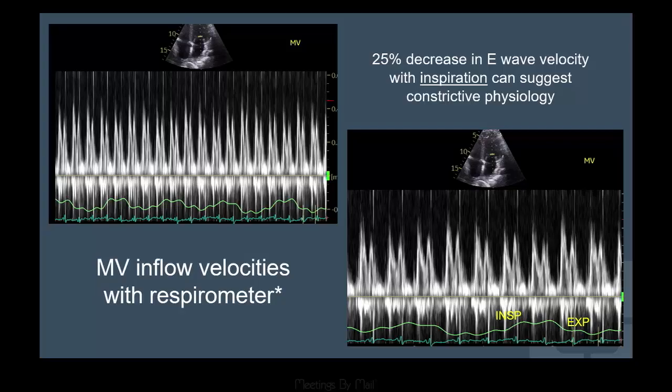So the most should be, imagine like a cash register. Tricuspid should be very, very dramatic. Also, the lateral mitral should be very dramatic, and septal should be the least. And in constriction, the septal is the only one, since the two walls are sort of retained by the thickened pericardium, that's why the septal is so high. Very few conditions will cause that.